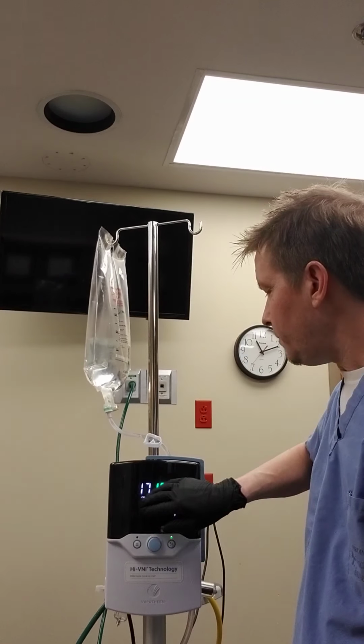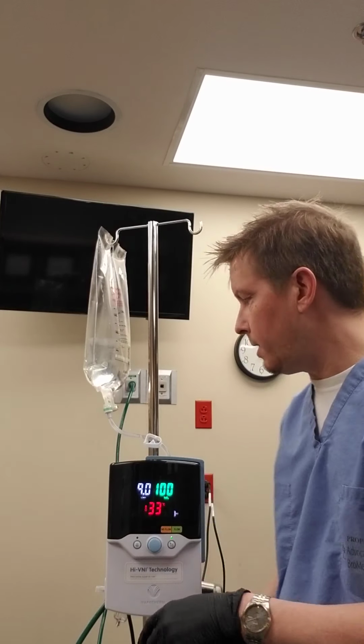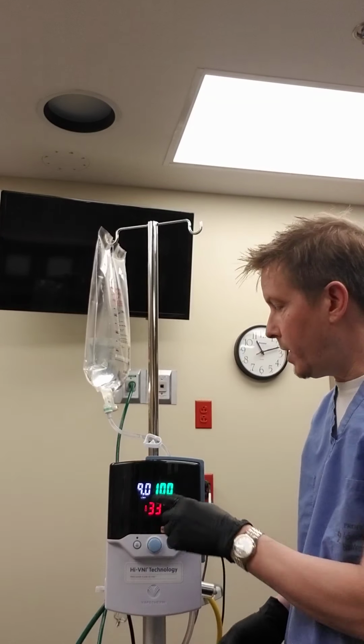One of the questions out there is, how do we know which one to wean, to titrate, turn up, turn down? Well, you're monitoring two things. You're monitoring shortness of breath, that's your flow rate, or you're monitoring hypoxemia, and that's going to be your FiO2. For instance, you have a patient who is complaining of shortness of breath, but their oxygen saturations are 100%. That's great. You're going to optimize flow for shortness of breath, and you're going to be able to wean FiO2. Or you have a patient that isn't complaining of shortness of breath, but their SATs are 90, 91. Then you can decrease flow rate and keep their FiO2 wherever it is to meet your oxygen therapy protocol, greater than 90 as general. That's how we adjust the settings. And again, temperature based on patient comfort.